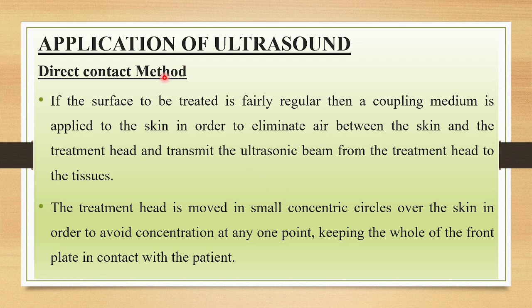There are different methods, like the direct contact method, the water bag method, or the water bath method. All these methods can be used according to the situation. The most commonly used method is the direct contact method. If the surface to be treated is fairly regular, then a coupling medium is applied to the skin in order to eliminate air between the skin and the treatment head and transmit the ultrasonic beam from the ultrasonic head to the tissues.